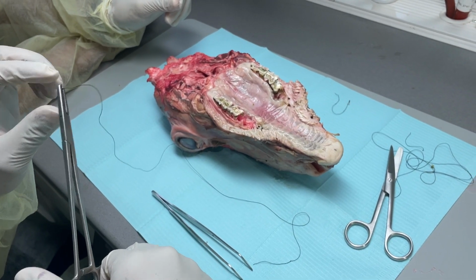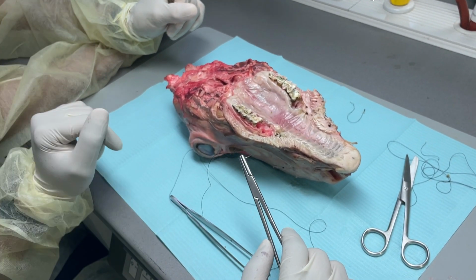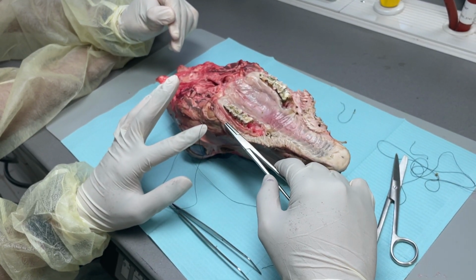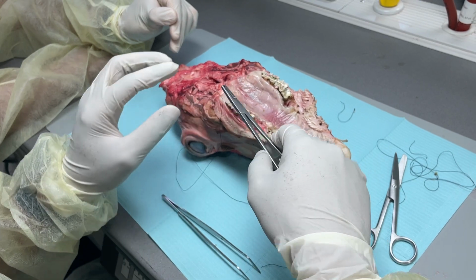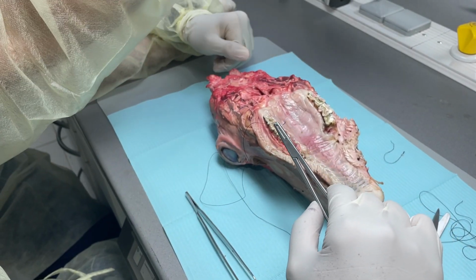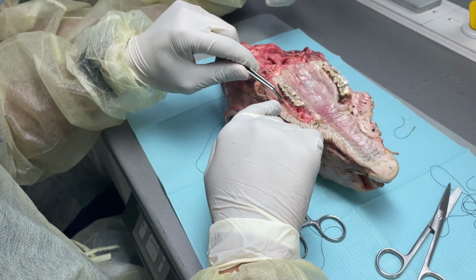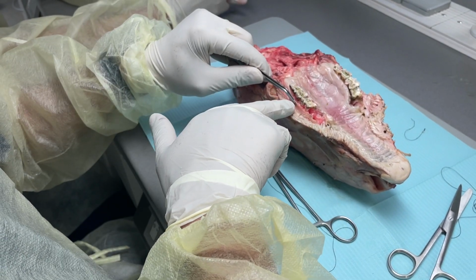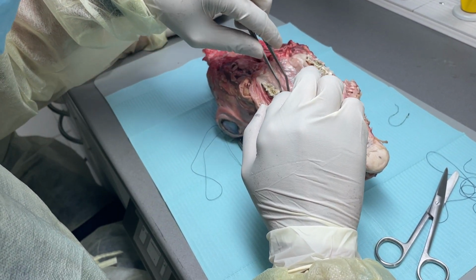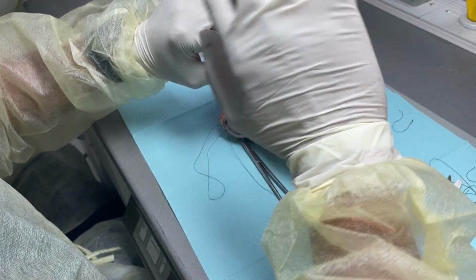Now, the interdental figure of 8. In the interdental figure of 8, same thing. You go from here, one, then on this side you will come from the external surface. Earlier you came from inside. Understood? We go distal lingual. Now, from the external buccal I entered. I exit from here. Here I will enter from the external surface. It's always toward the tooth. Clear? I'll show you.